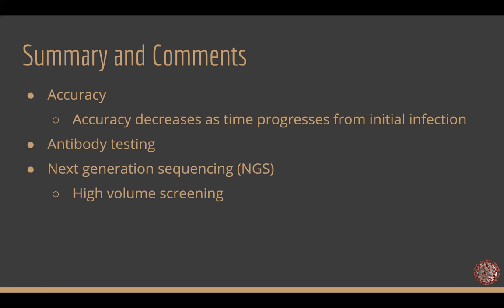Another really great test out there that is being developed is next generation sequencing, which will essentially allow us to test for coronavirus at a much higher volume.